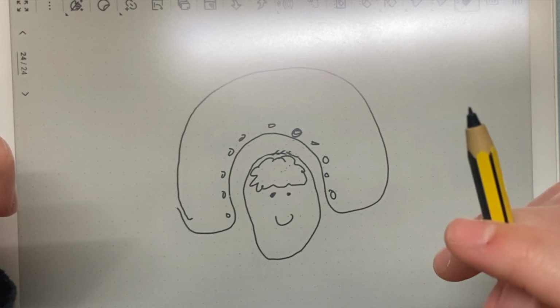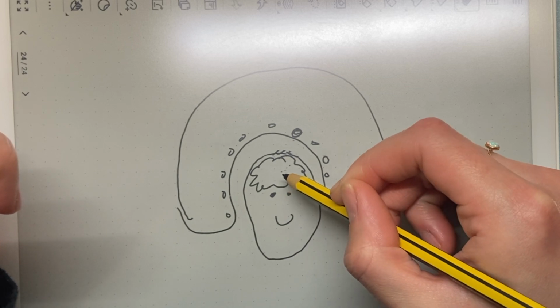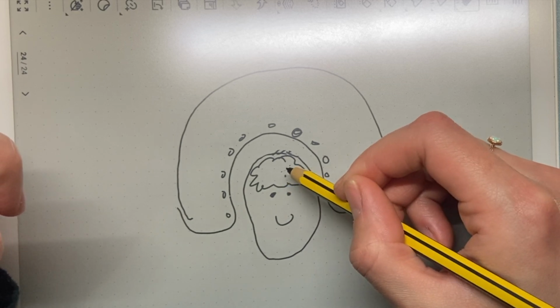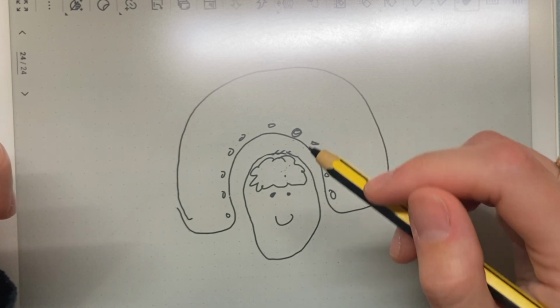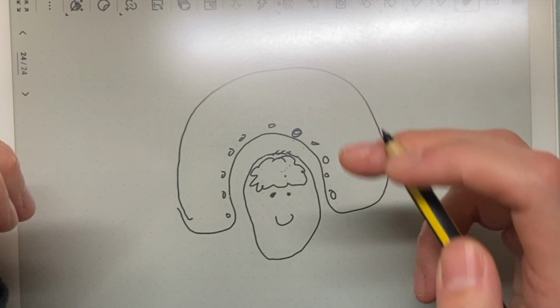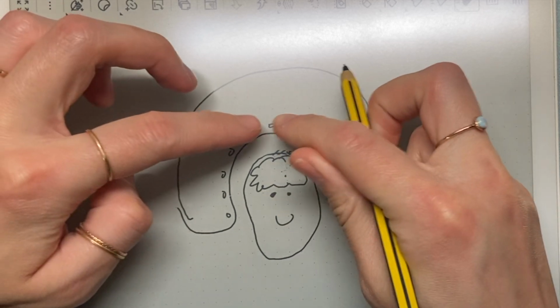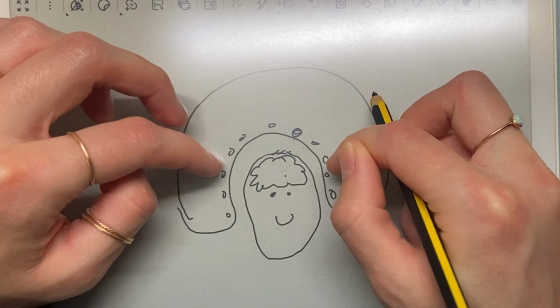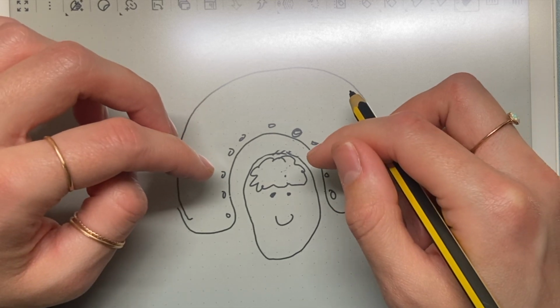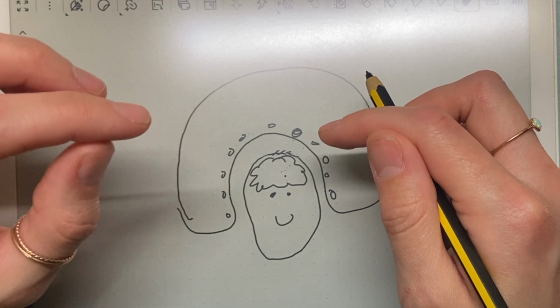In order to do this operation, we need two things. The first is that we need to know the shape of the brain, and we can potentially get that from an MRI, but if we don't have an MRI, that's still okay. We can estimate it. The second thing is that we need to know the location of the person's head inside the helmet. And I think that people often overlook this detail, but I think that it is actually very important.